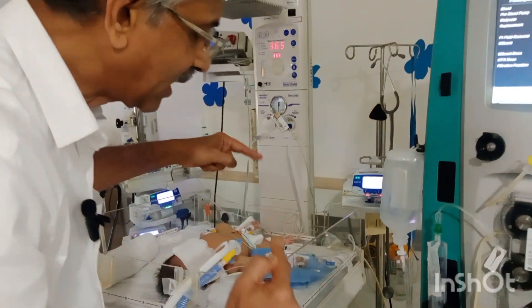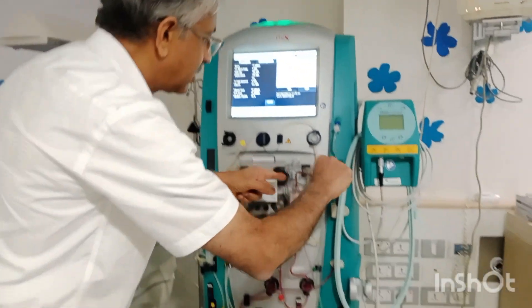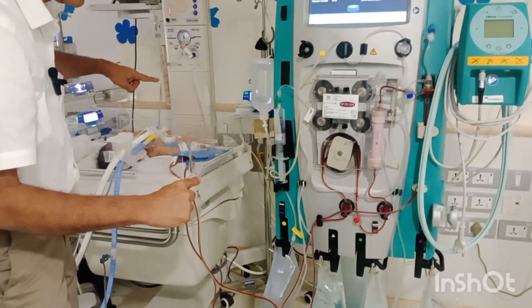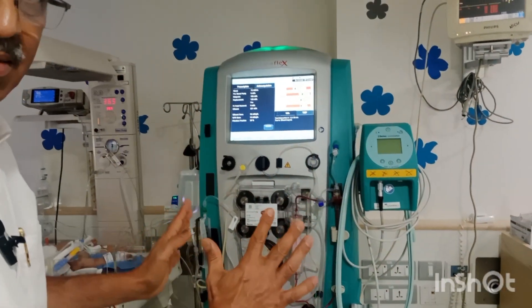So, the arterial line draws the blood, post-filter the blood undergoes exchange, and then it goes into the baby's system through the umbilical vein. This is how the dialysis machine works.